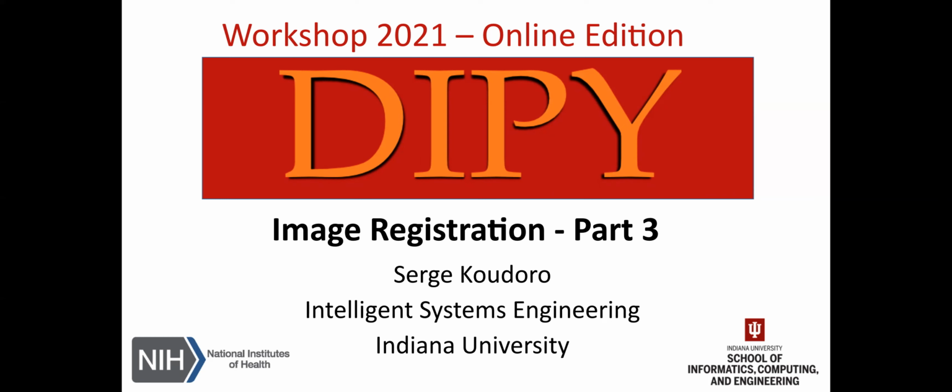This is part 3 of the image registration session. If you have not seen part 1 and part 2, I recommend you start with them because I will skip many concepts. In this part, we will focus on non-rigid or non-linear registration.